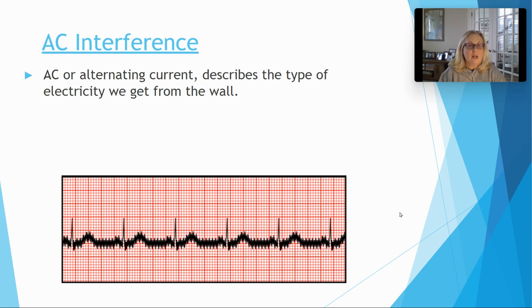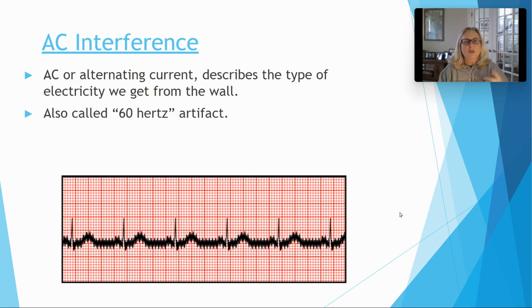So if you guys had your EKGs taken by the last class and they asked you if you have your cell phone on you, this is why, because it can cause artifact, okay? It really only causes artifact if it's buzzing or if you're getting notifications or if someone calls you. If it's sitting idle, it's probably not going to do anything. But most of you with your Instagrams and TikToks and all that stuff, the phones buzz all the time. So you definitely probably want to make sure they're away from the EKG machine while you're doing the EKG. Okay.